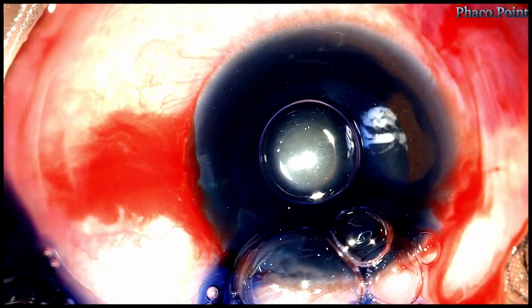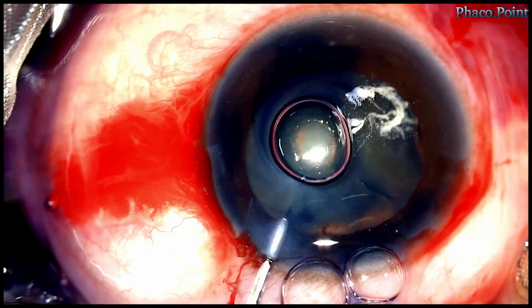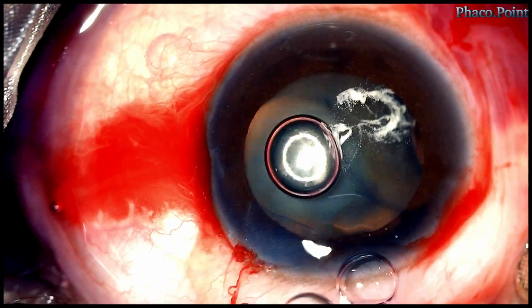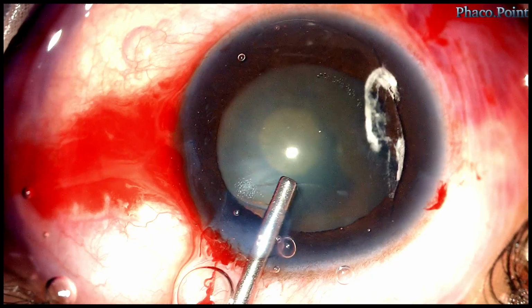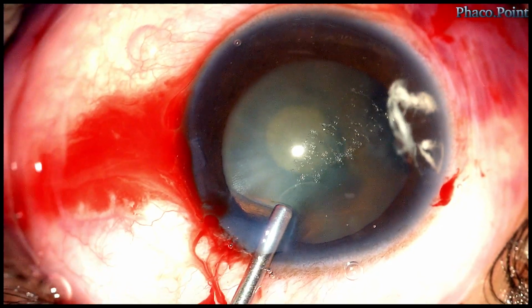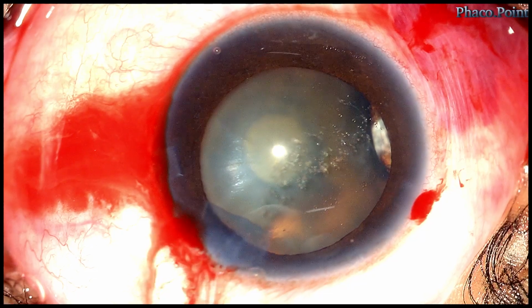Next, I stain the anterior capsule with blue dye prior to performing the capsular rhexis. But as I wash out the blue dye, once more I see the prolapsed vitreous. Once more I inject some viscoelastic into the anterior chamber, and once more the strand of vitreous goes behind the lens into the posterior segment.